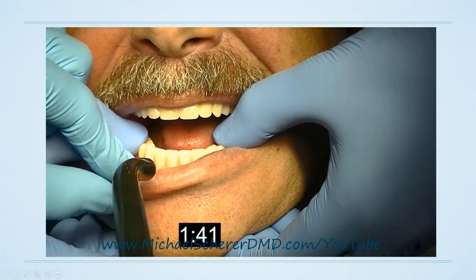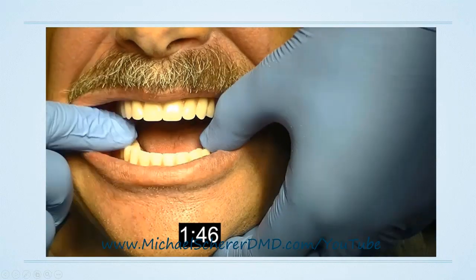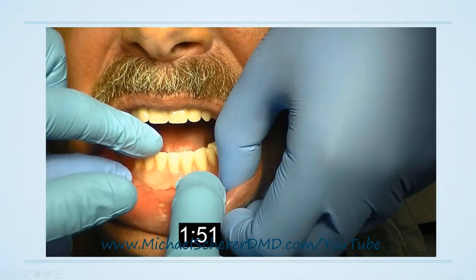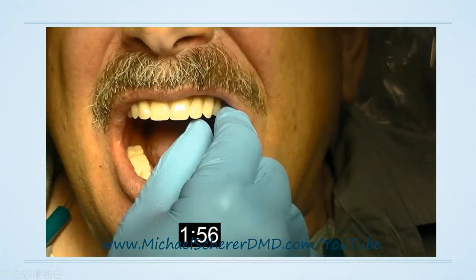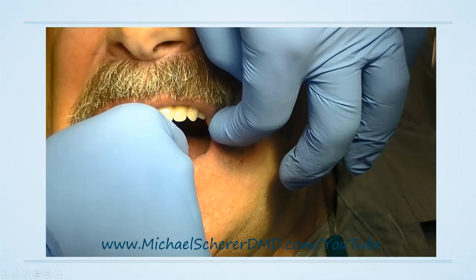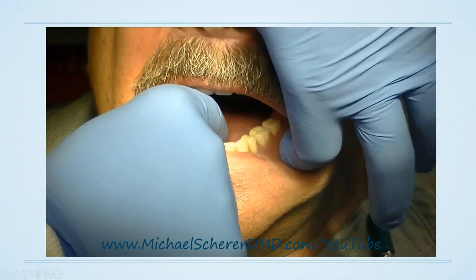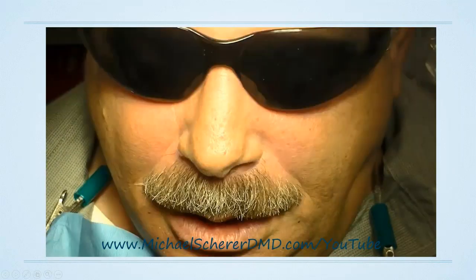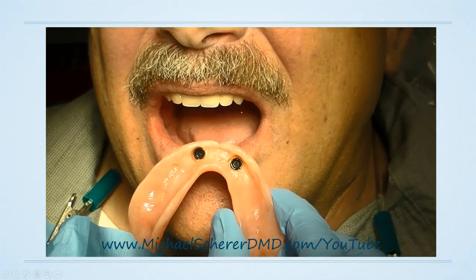If I have the patient bite down and it lifts the denture up a little bit, it's going to glue the housing at that higher spot. And then when I snap the denture back in the mouth, it's actually going to be lifted off the soft tissue on that side, causing it to be more implant supported than implant retained. The clinical effect of that is that if you have more implant support to your locator, you're going to have accelerated wear of your nylon insert, or you might not feel a good level of retention strength with your blue or your pink inserts.